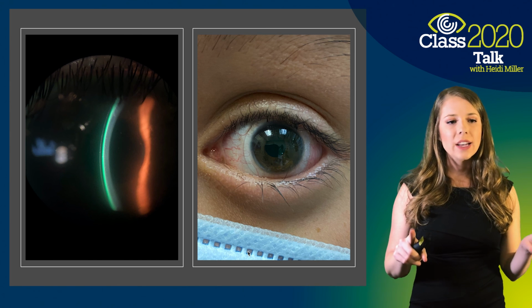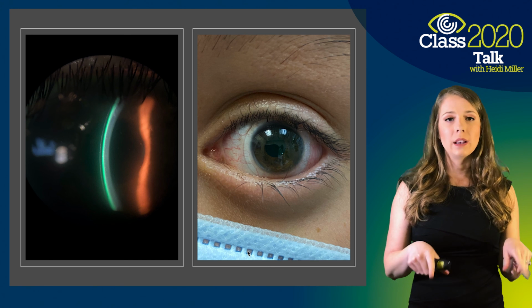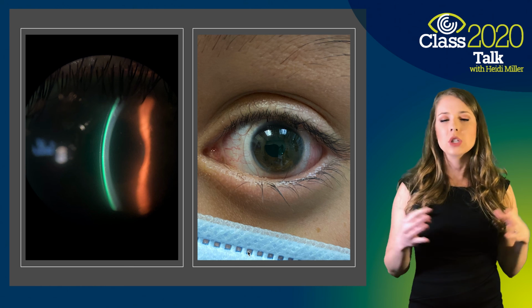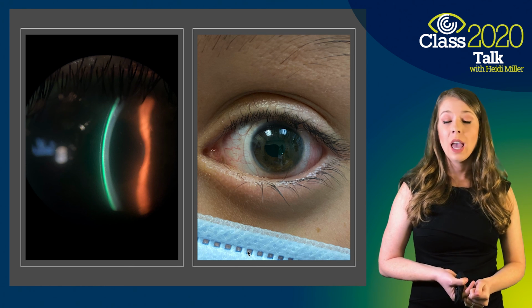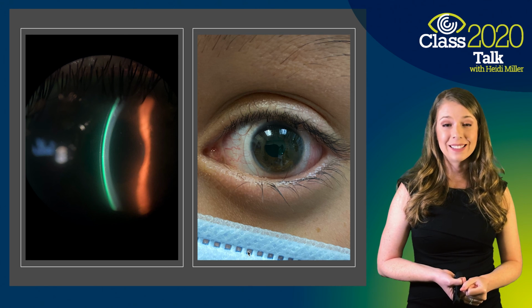But you can see on the edges, she still has some redness there. And that's just from being exposed to those areas. So over time, I think what we'll do is we'll eventually go a little bit bigger just to cover a little bit more of those exposed areas and hopefully help with some of that dryness. But it's night and day difference for her. So it's been amazing.